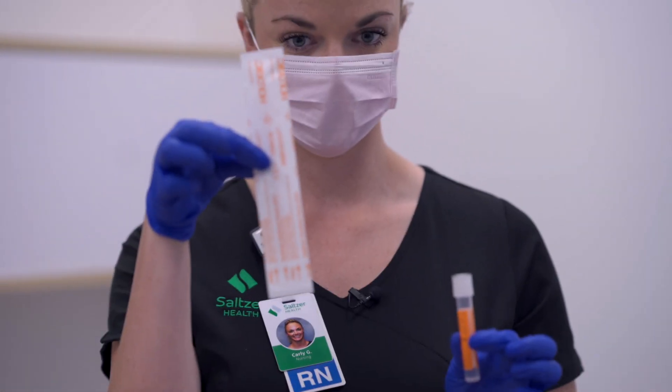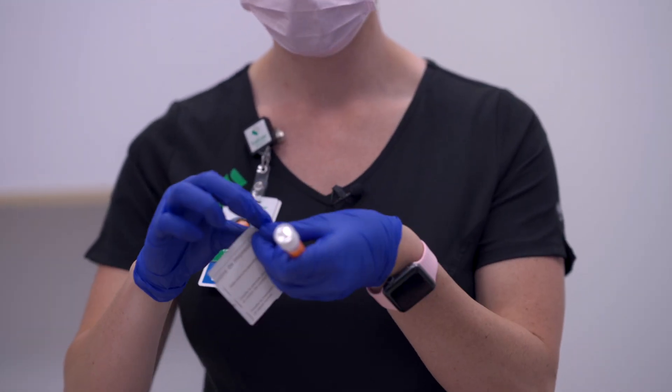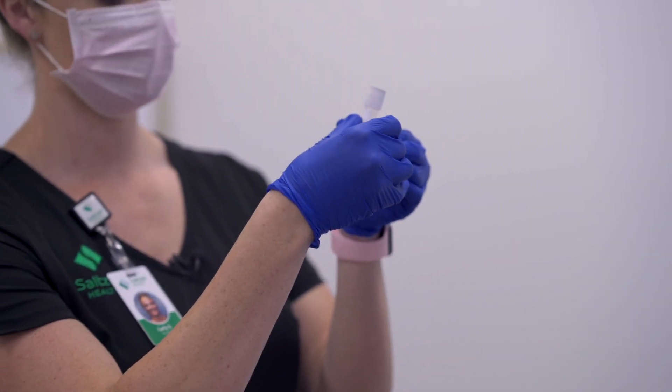Next we're going to remove the swab from the packaging. You'll have the tube holding the medium and then the swab itself. Go ahead and place that patient sticker onto the tube.